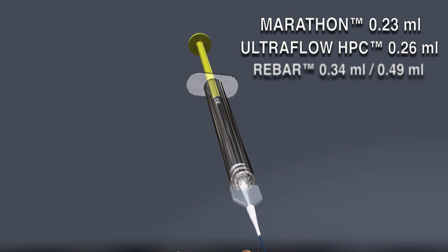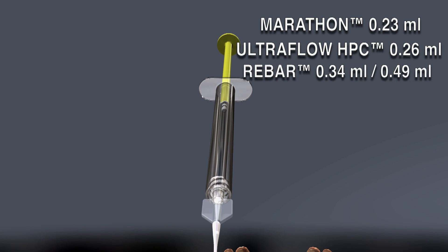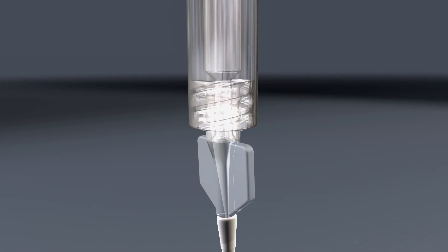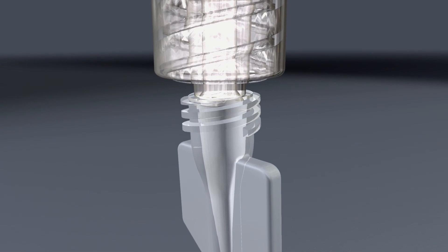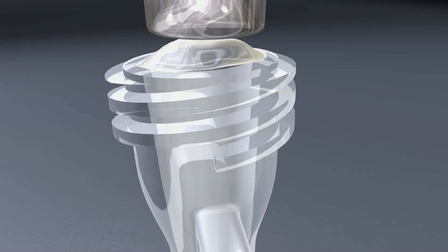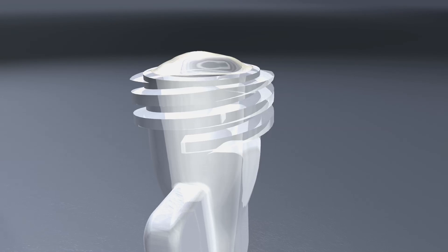The catheter dead space is called out on the catheter package, and in the case of the Marathon Flow Directed catheter, the dead space is 0.23 milliliters. As soon as the DMSO has been injected into the catheter dead space, remove the DMSO syringe. Hold the catheter hub in a vertical position and overfill and wash the lower hub with the balance of the DMSO, creating a meniscus of DMSO in the catheter hub.